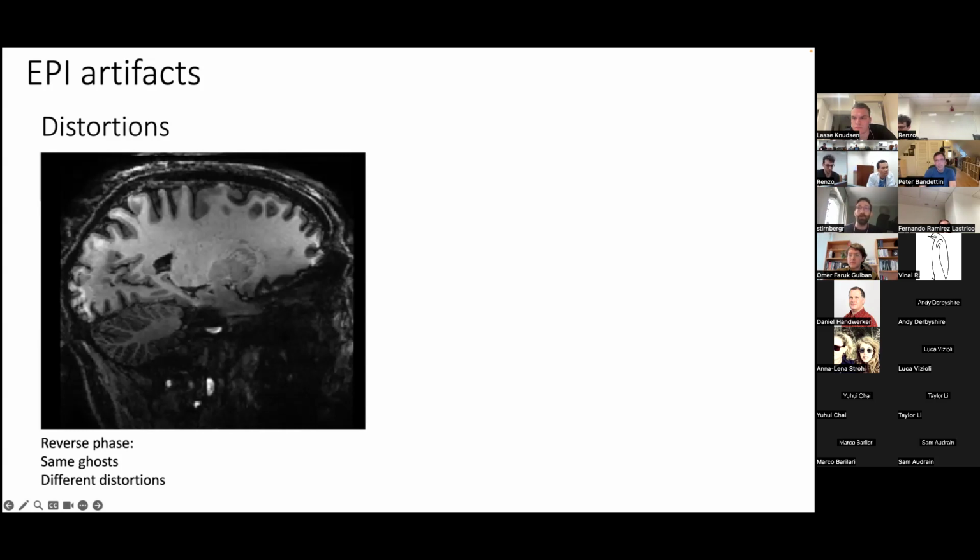So I assumed a little bit it was taking the field map from TOPUP and applying it in a way for matching the distortions. But then again, you also said that TOPUP is not perfect, so it's kind of contradictory. It's difficult, but I think that's also critical.